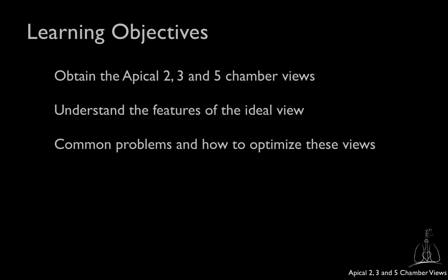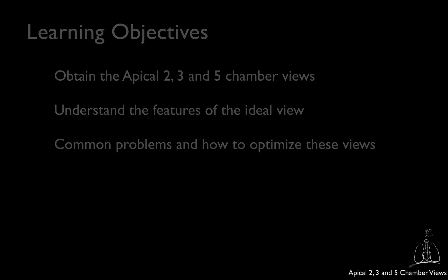The purpose of this video is to show you how to obtain the apical 2, 3, and 5 chamber views. We will first describe how to obtain the views and will then provide some tips to optimize the view.